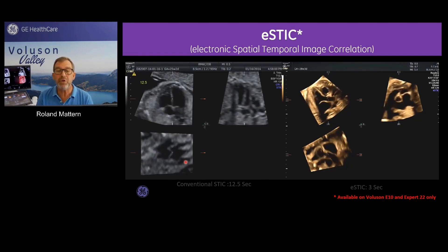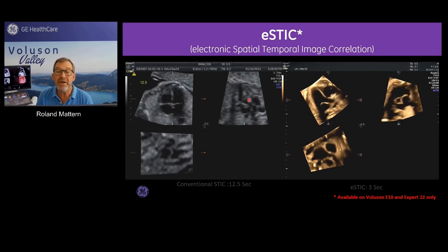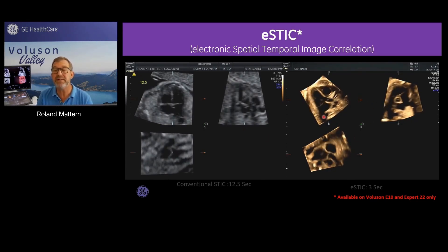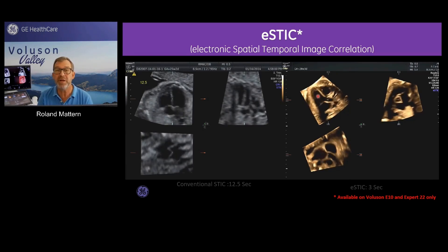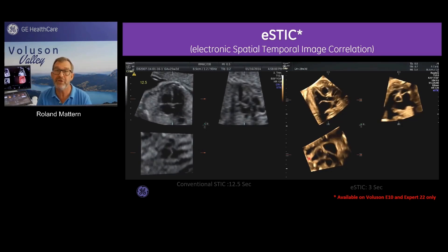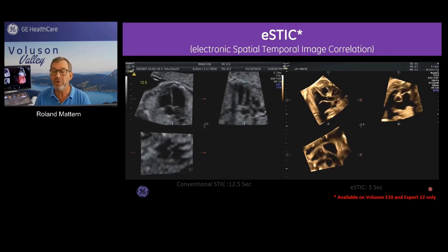Just a simple comparison: normal STIC has excellent image quality but still some movement artifacts. In E-STIC, quality is a little higher, especially for multi-planar imaging - looking at the A, B, and C planes - with very high image quality in all three planes. By the way, E-STIC is only available on an E10 or Expert22.